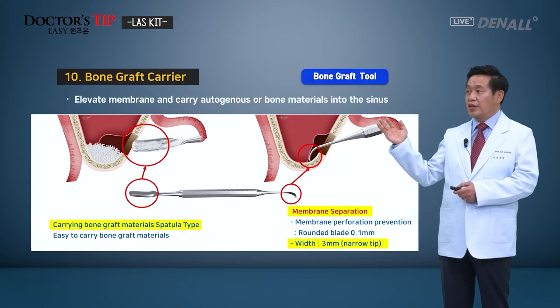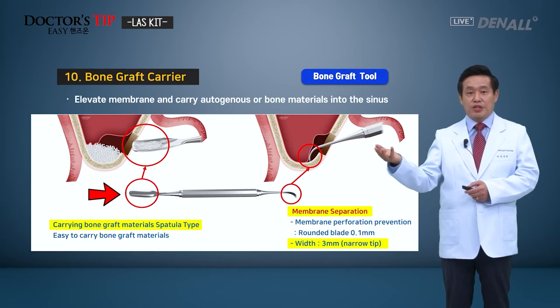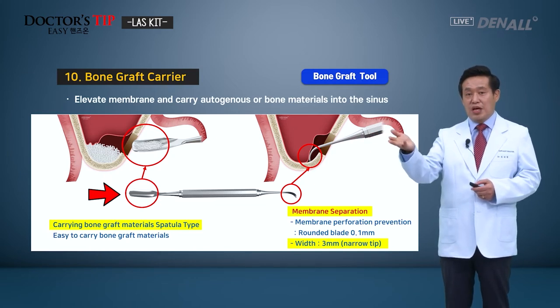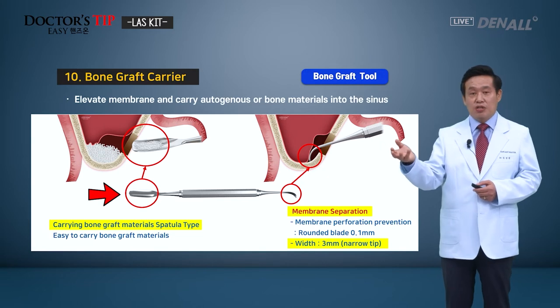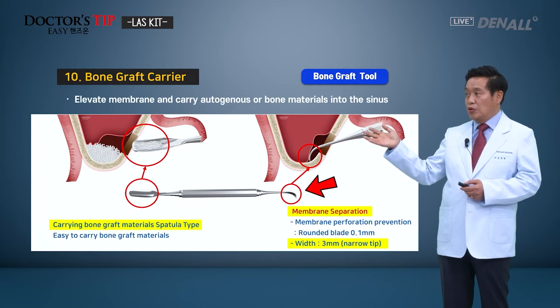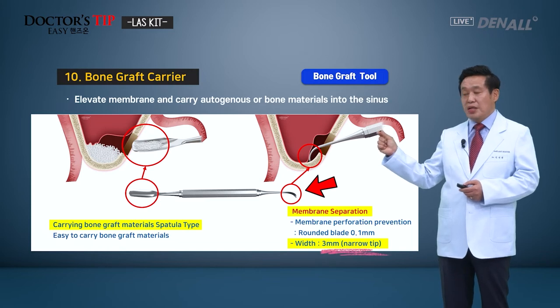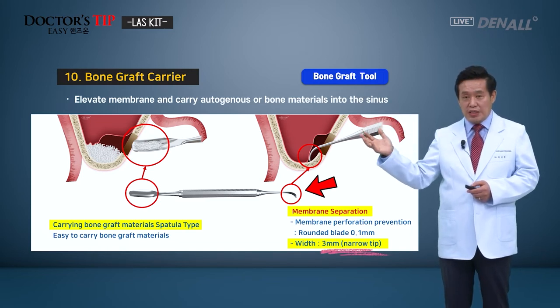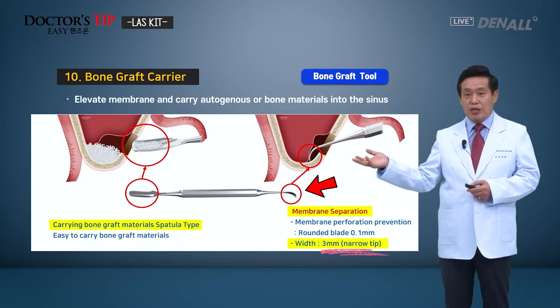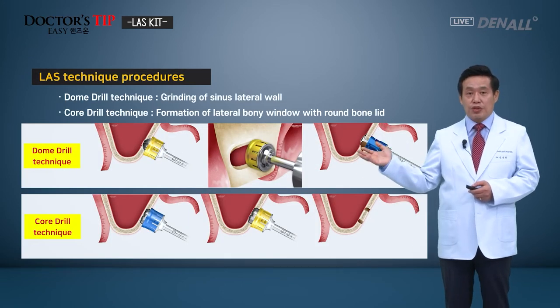Next is the bone graft carrier. On one side, you have this type of spatula shape. So graft material, without contaminating the mouth, you can bring it to the lateral window and do bone grafting. On the other side, the freer elevator's width, I said, was 5 millimeters, but this is a bit narrower tip. It's 3 millimeters in width. So if the lateral window that you formed is a bit narrow, then you can use this narrow tip for membrane elevation.